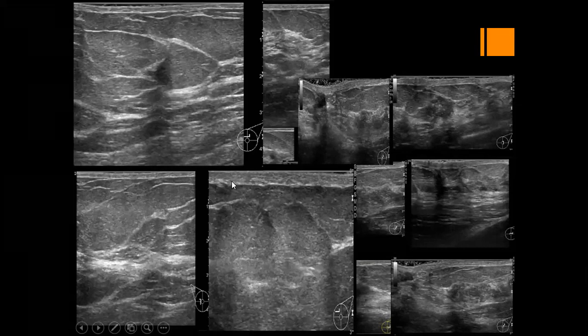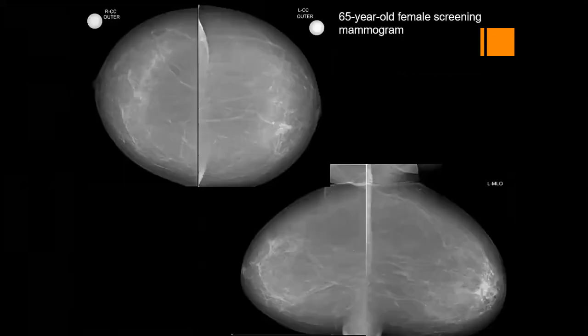However, look at the skin thickened. Compare with the contralateral, same breast, same area. The contralateral is clear, but on this breast, the skin is thickened. The findings are suspicious, and we recommend re-biopsy because the first biopsy was negative.